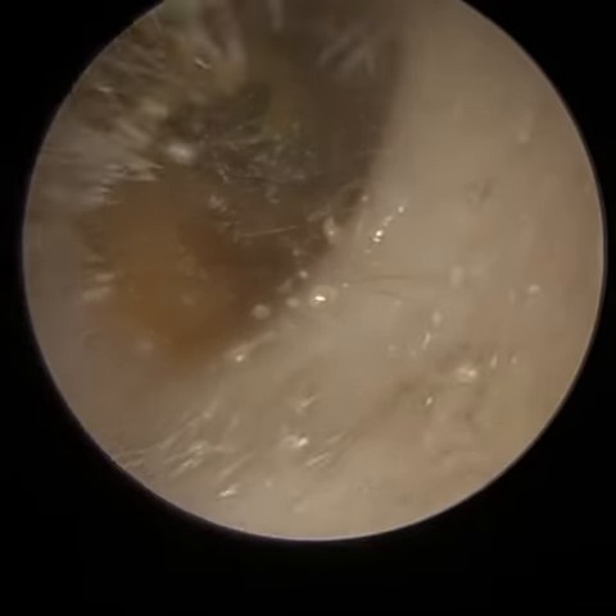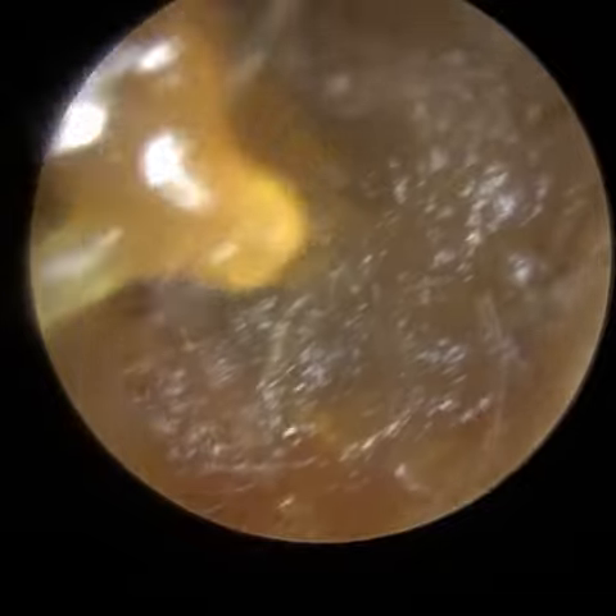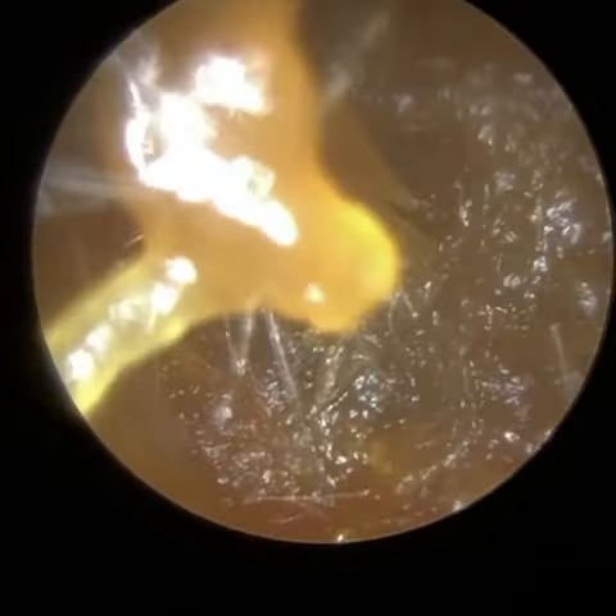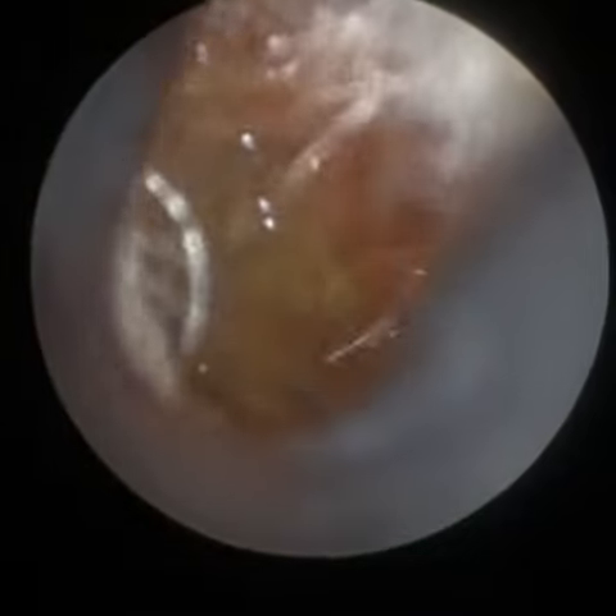You may notice that clip there wasn't actually taken with the Waxscope — it was taken with the iClearscope Endoscope, which is our flagship product and which is still available. I've also slowed the clip down, because I feel it gives you a good perspective of this patient's ear canal anatomy. In particular, the left ear, which is very narrow and bendy.